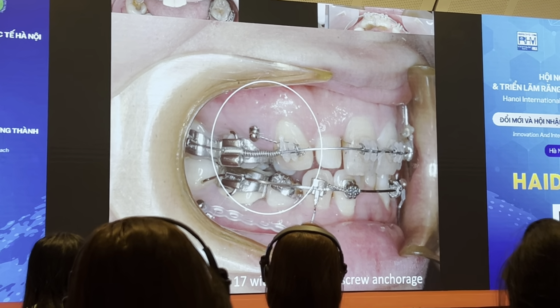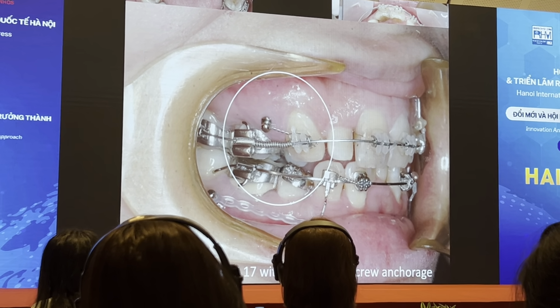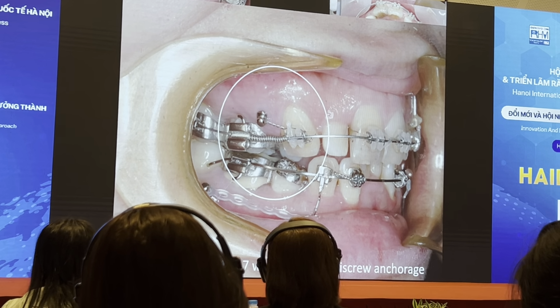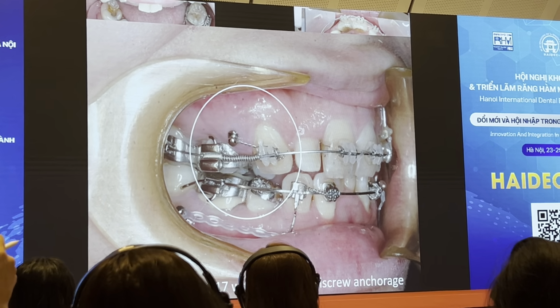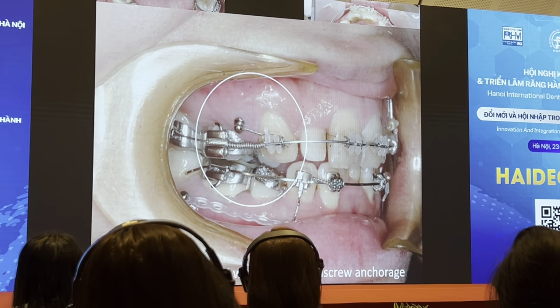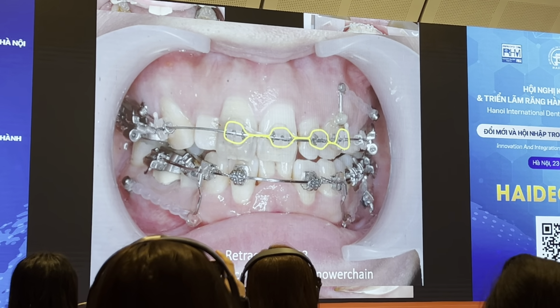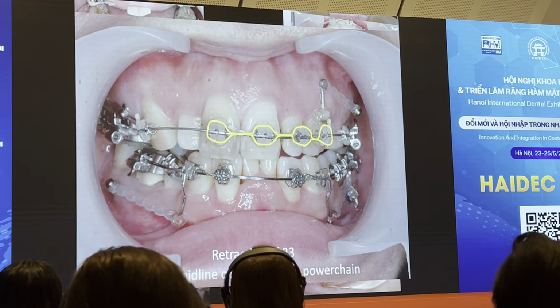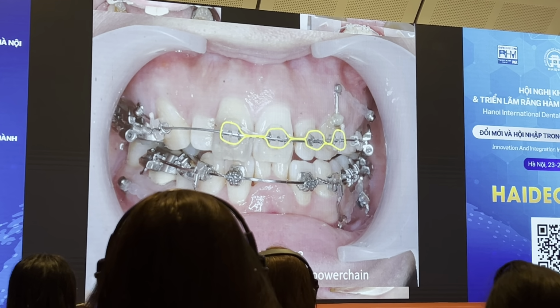Next, 1-6 and 1-7 were distalized with indirect skeletal anchorage. It means that an opening coil was used to push 1-6 distally against 1-3, but the mesial movement of 1-3 was prevented by the steel ligature which connected to the miniscrew at the 1-3 distobuccal region. At the same time, pulling was used to correct the upper midline by moving the incisors to the left when 2-3 was being retracted.